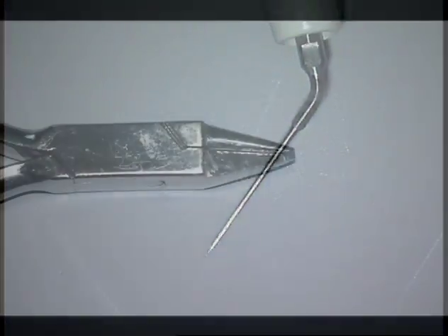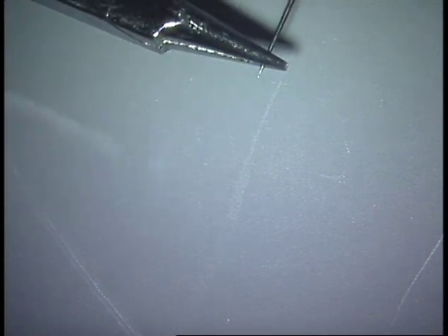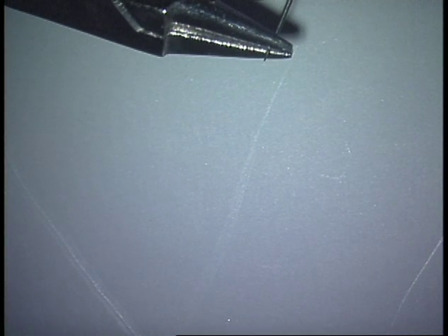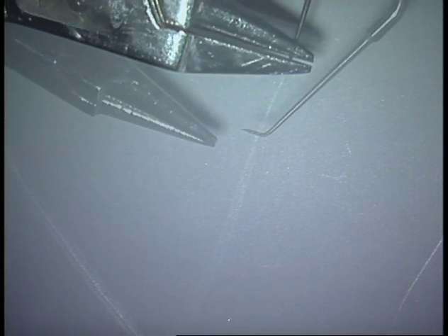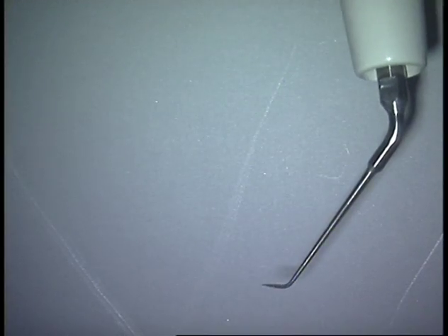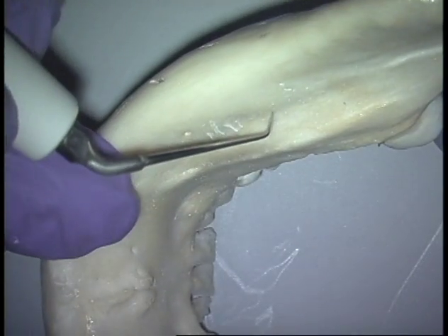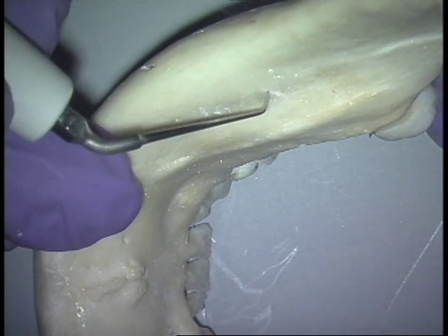If you need a longer ultrasonic tip, all you need to do is take these orthodontic wire benders, select the place where you want to have the bend for your surgical procedure. Slowly and gently bend the tip to the appropriate angle that you need, and now that tip will function as a custom-made surgical tip and it will not break.